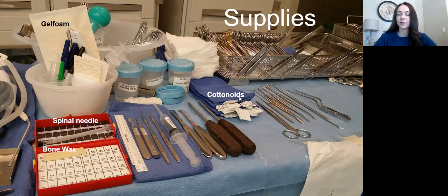So cottonoid patties, this is one of the supplies I was talking about that can be used for brain retraction. One of the surgeons I worked with that did not use brain retractors used lots of these cottonoid patties and you would stack them on top of each other and it would slowly but surely retract that brain tissue back. And it's got that long string attached to it and you can pull on that string gently too. So a soft cottonoid patty is another thing that can be used to pad the brain with retractors or without retractors, as I'm telling you.